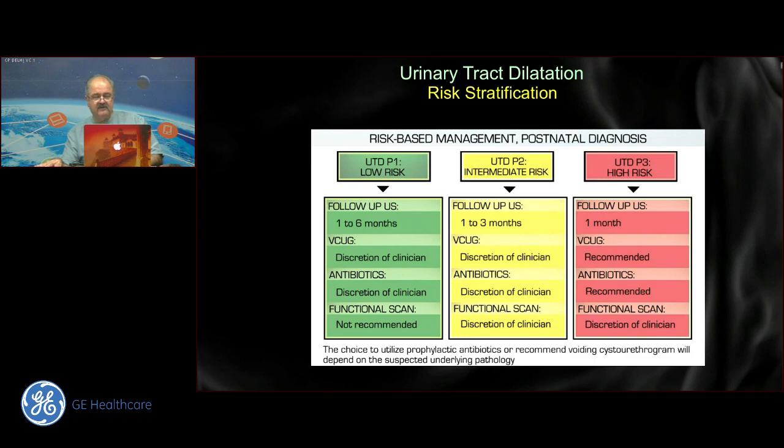Can unilateral hydronephrosis be considered a marker of genetic sonogram? It is. It is definitely a marker. It is one of the 8 findings. It has a positive likelihood ratio and a negative likelihood ratio, and we will use that as a calculation. Of course, if you've done an NIPT, we don't need to use it. If you have a calculation of 1 in 10,000 as your a priori risk, you don't need to use it. But it sounds nice on a mathematical report if you say, yes, a priori risk 1 in 8,346, this is present, and therefore now my risk changes to 8,994, or whatever figure it turns out to be. Simple. Any more questions?